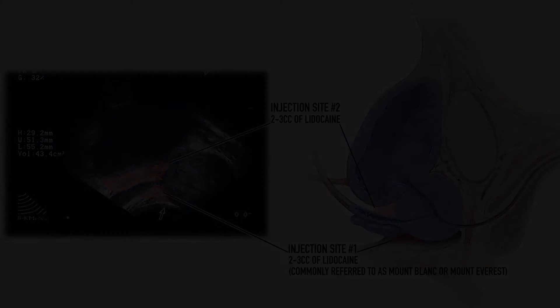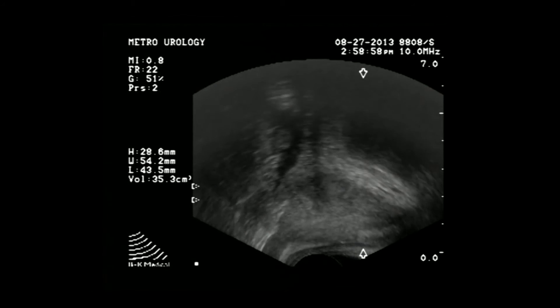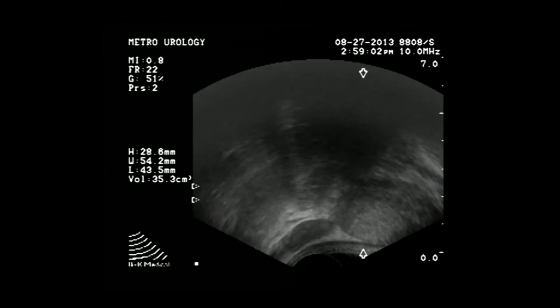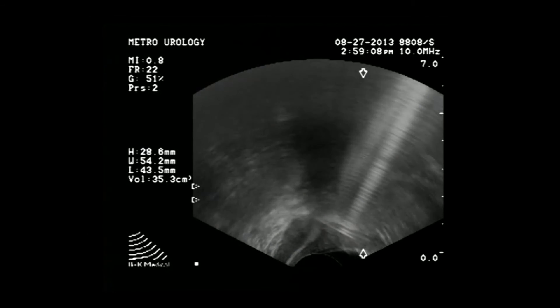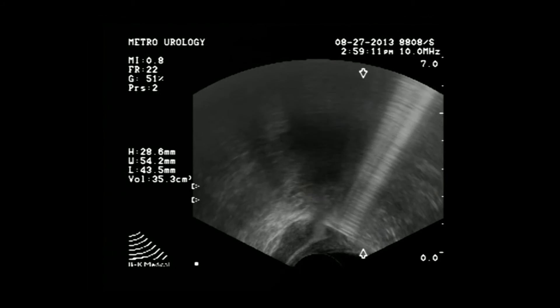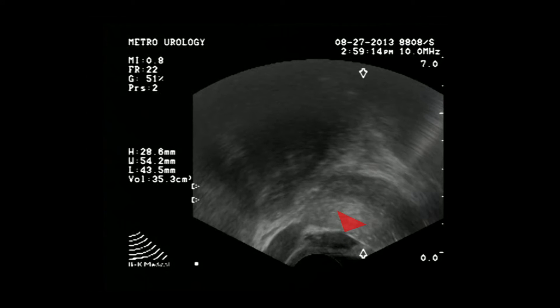Now let me show you how I do it. On our picture you will see the prostate, seminal vesicle, the traditional Mount Blanc site, and then above that you will see a hyperechoic area. My needle is going now into the traditional site of Mount Blanc — about 3 cc's will be injected in this area. Then I pull the needle back and leave another 1 or 2 cc's between the prostate and the rectum.